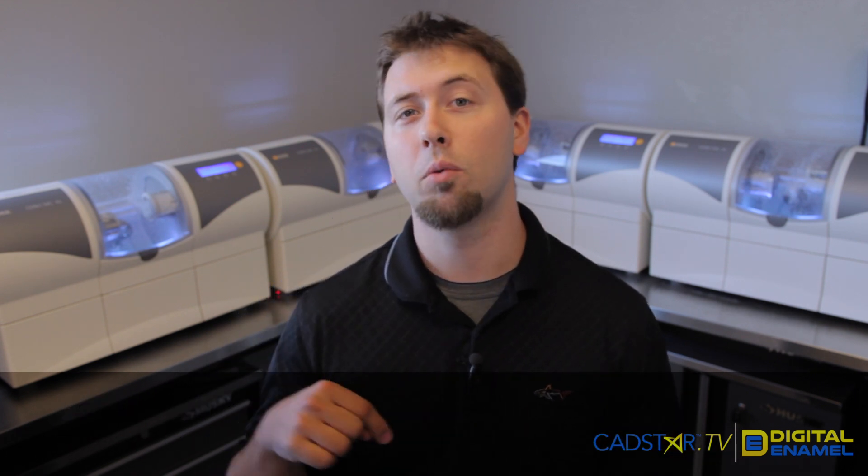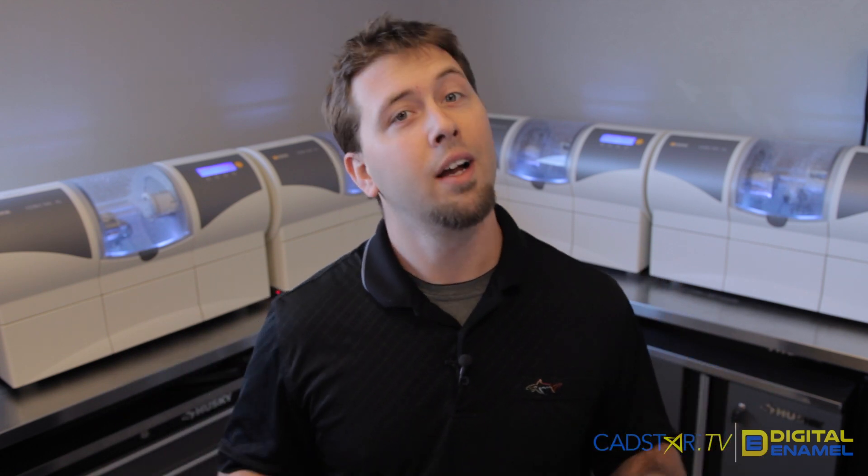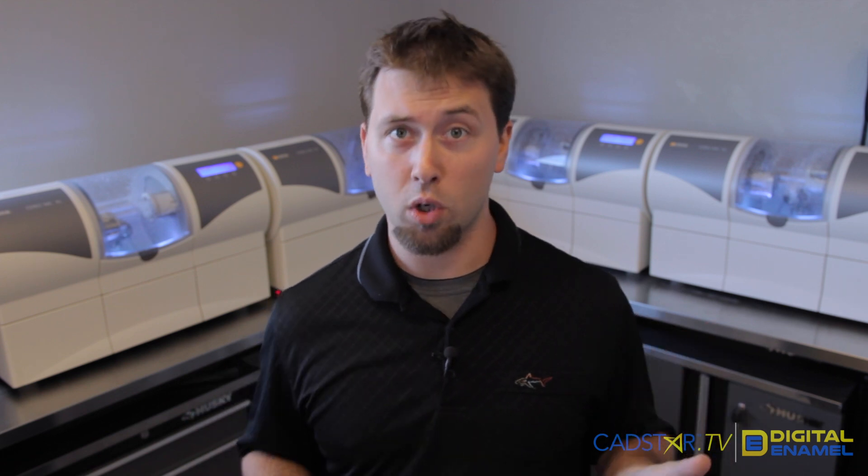Hi, my name is Justin and I'm here at CADSTAR Learning Center in the West Coast Digital Enamel Campus. Today we're going to talk about troubleshooting your MCXL — getting through error messages, getting it cleaned out, and making sure it works for you.